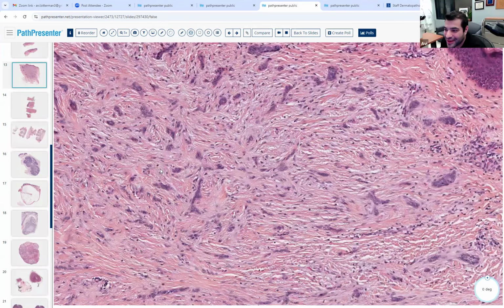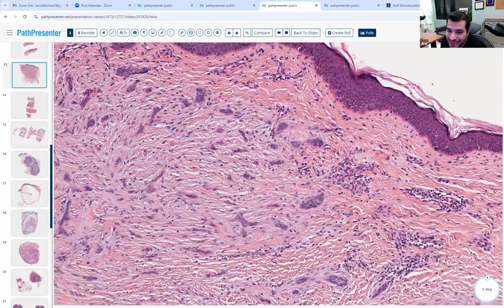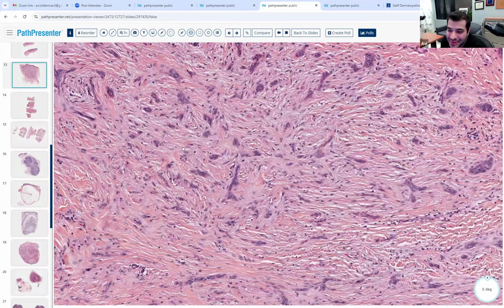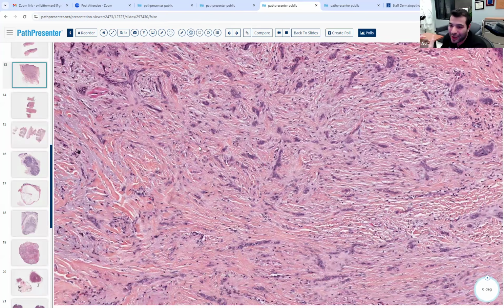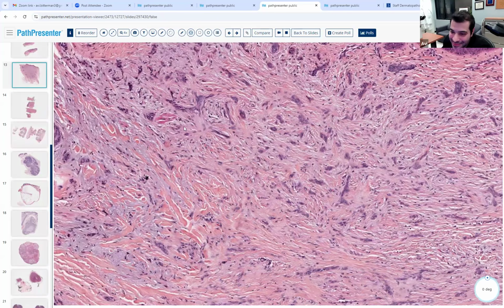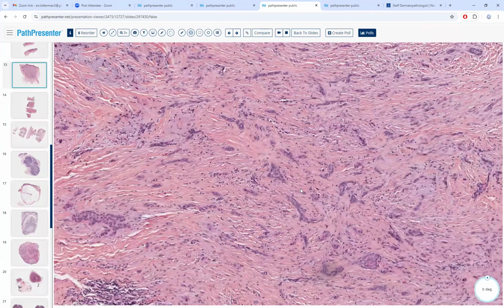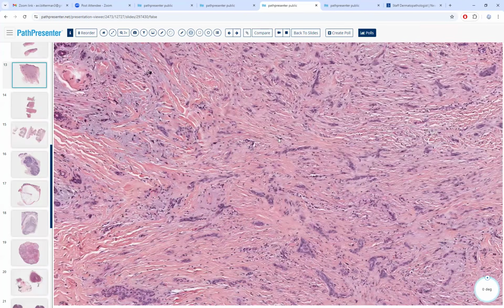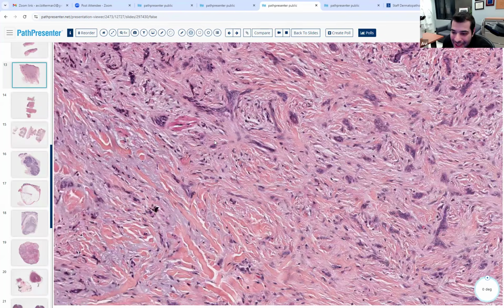In a lot of it, I mean, it has some parts that can resemble it, but the reason it's hard to see in many areas is because you don't have the cyst to make up the bulb of the paisley tie or the duct to make up the bulb of the paisley tie. Also, this tumor is kind of peppered with a lot of inflammatory lymphocytes. So that's probably not a good. Not quite. I mean, not a whole lot.